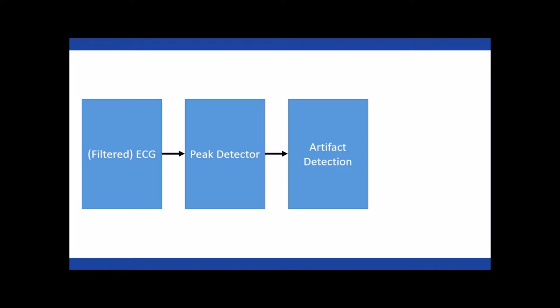This peak detector is not perfect. It can struggle with non-normal data, which can be caused by motion noise, poor electrode placement or connection, or electrical interference like 60 Hz noise caused by surrounding electrical equipment. So we want to take these peaks and determine whether or not they might be artifact or error introduced by the peak detector.